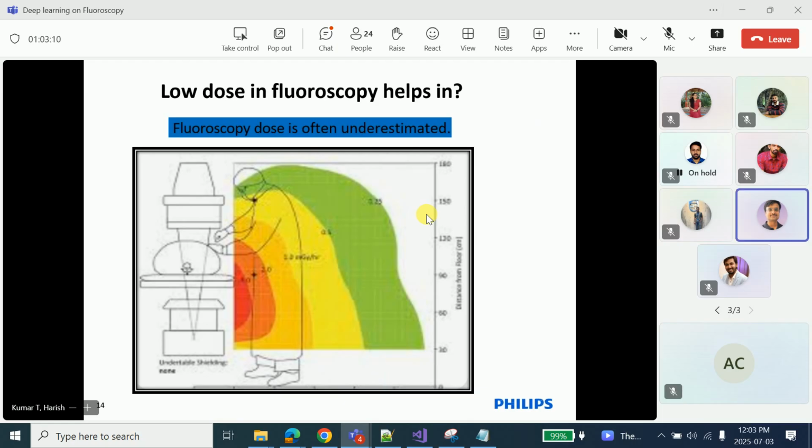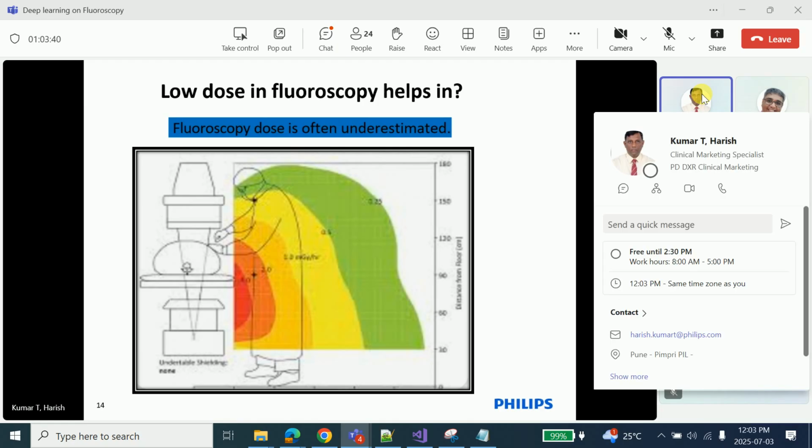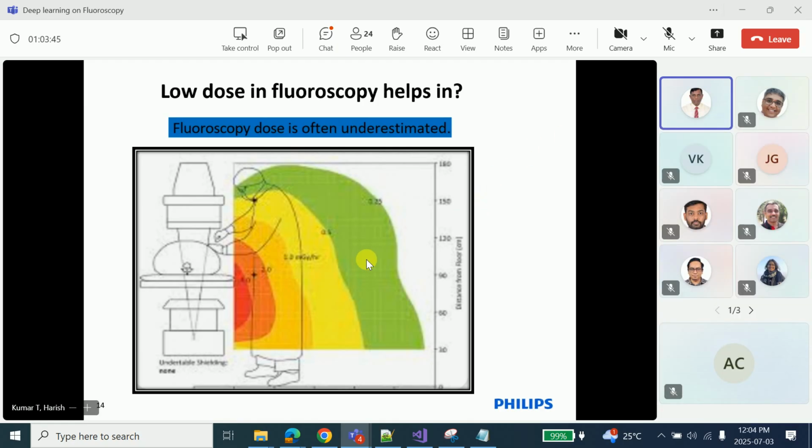Harish, one question. Yeah. What is the maximum dose which a person can get in a year? Is it 200 millisievert or is it less? No, it is not 200. It is lesser. There are doses for the radiation worker and doses for the general public. I think it is 20 millisievert. Oh, it's 20 in general. Okay, and the public radiation dose can also include all other doses from the atmosphere, like cosmic radiation and other background radiation.